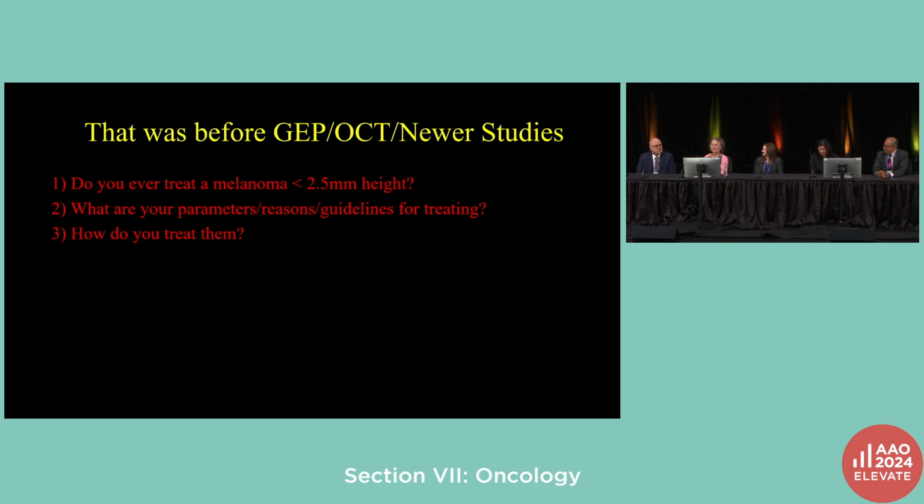All right, Carol, you see these lesions. Which ones do you think you ought to be intervening in? How do you decide? We tend to use clinical risk factors: thickness over 2 millimeters, fluid on OCT, orange pigment on autofluorescence, vision loss, diameter greater than 5 millimeters, and ultrasound hollowness. And if a patient has maybe 3 or 4 of those risk factors, we would lean towards treatment and talk to the patient about it.